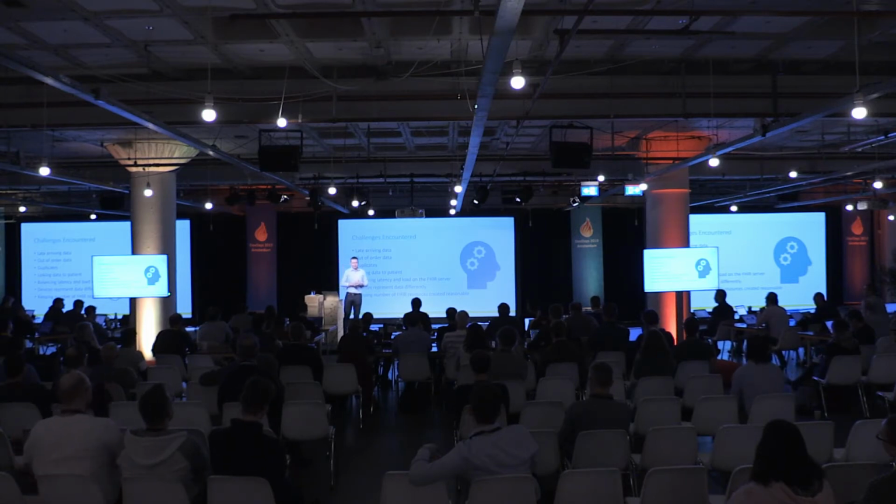Linking the data to the patient: the devices themselves rarely have actual patient data on them, and for good reason. So you still want to be able to link the data, once it's ingested into the cloud, to the correct patient, so it flows into their record.